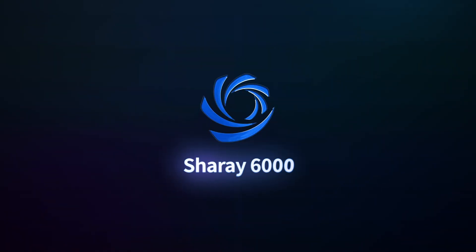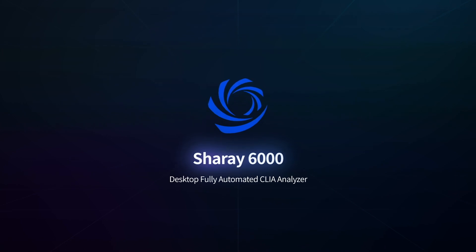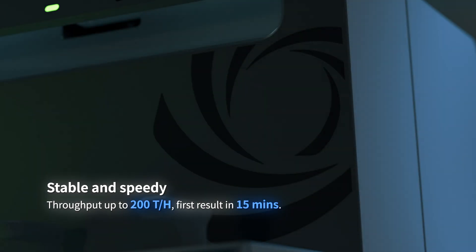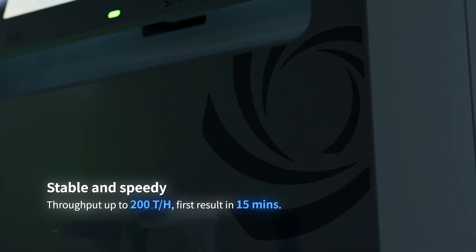Shurei 6000, Desktop Fully Automated Chemiluminescence Immunoassay Analyzer. Stable and speedy, with throughput up to 200 tests per hour and the first result available in only 15 minutes.